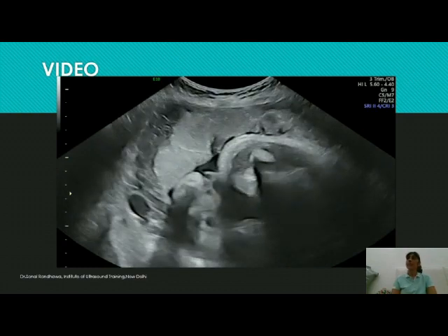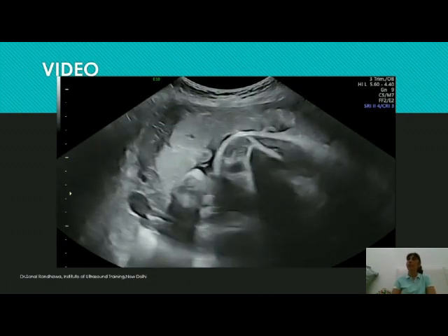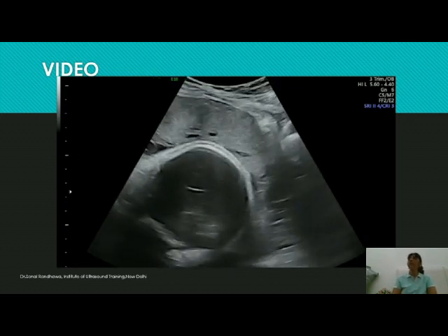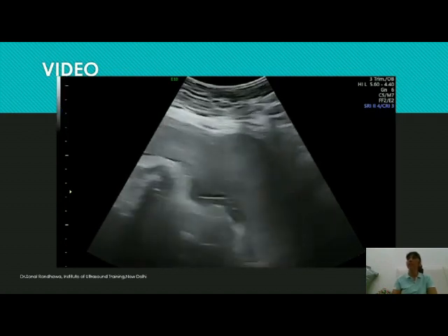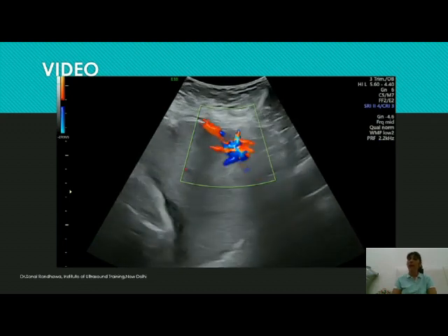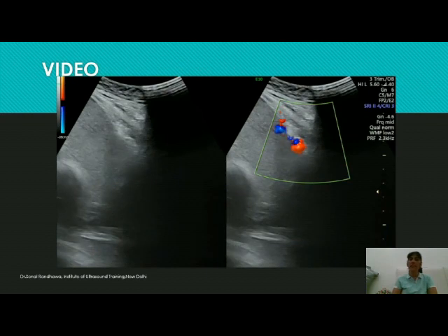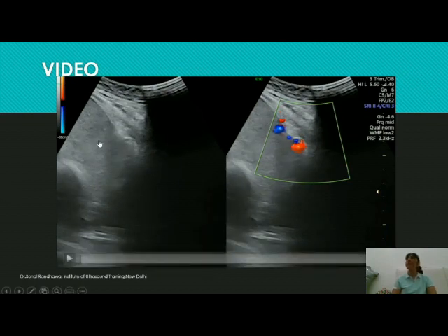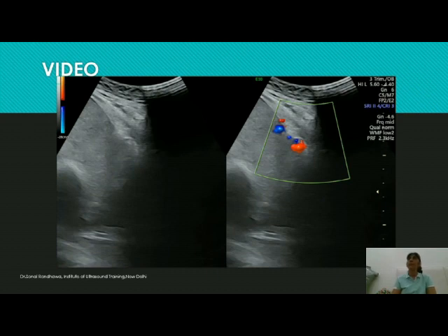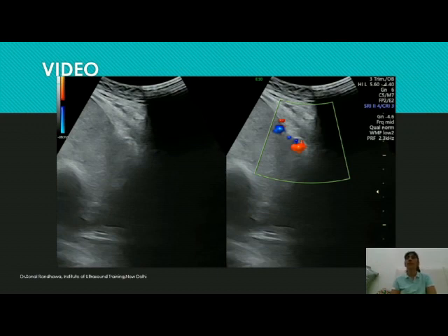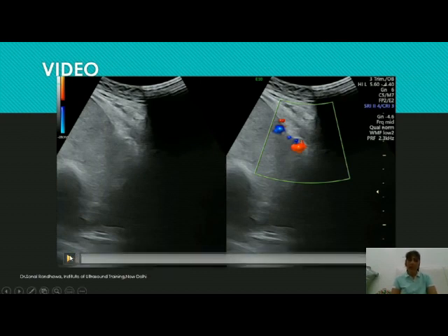Always make it a point to observe all features of the placenta, including the retroplacental space. Additionally, too many cystic areas in a localized portion of the placenta gives a high suspicion for placenta creta. However, in this case the placenta looks smooth without many cystic areas, so remember you cannot rely on one feature alone. Overall, irrespective of whether it is a previous cesarean or not, always assess the retroplacental space throughout so that you don't miss a case of placenta creta.